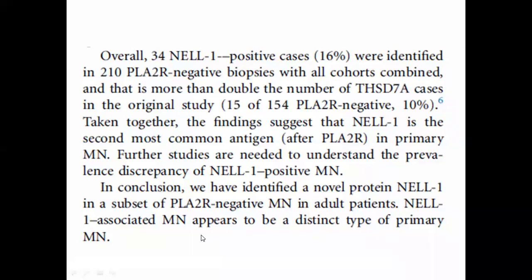Questions? Can IgM be positive in primary? So the thing is, I told you the most common thing you see is that the patient had PLA2R positive in biopsy, sir, but IgM was also positive in a case with IgG4 and IgG3. So IgG will be positive. Along with that, there could be a little bit of IgM. That is fine, but in the majority of patients, IgM is not commonly seen in primary membranous. It will be very unusual. An occasional rare case may be there, but it is not a common finding to see IgM.